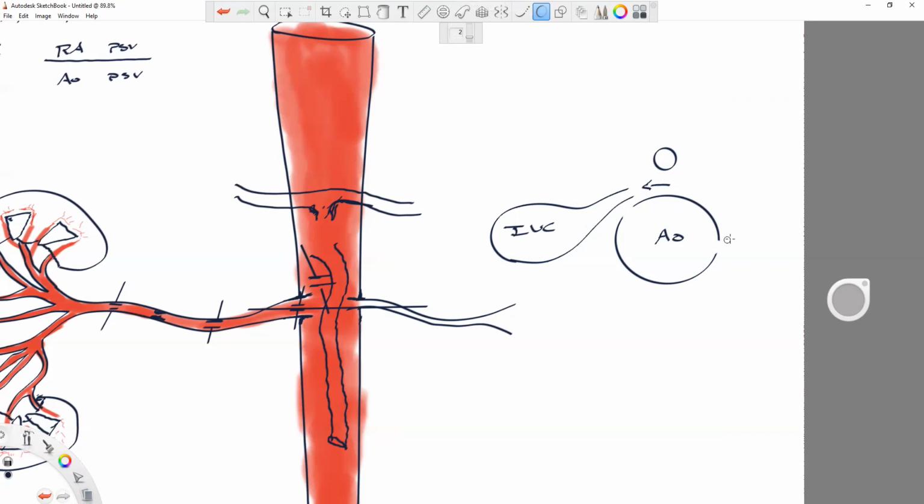Okay, erasing a couple of spots here for, of course, my renal arteries. So for some reason, this guy tends to go up and then down. And usually it's kind of hard to follow beyond here, so I'm just going to draw it that far. Now, if you're lucky, you'll see that much of the renal artery. And then on this side, it tends to go more or less straight down.